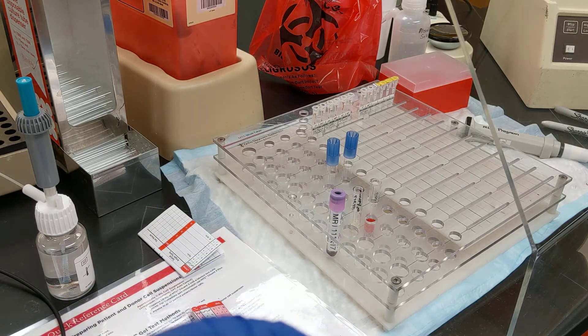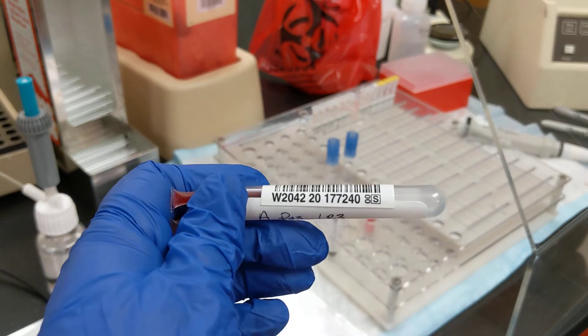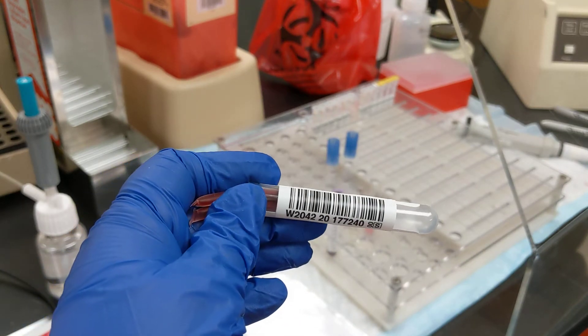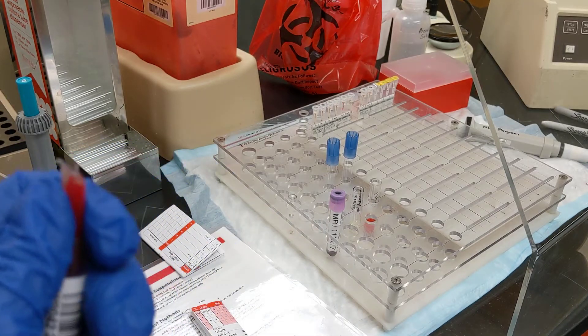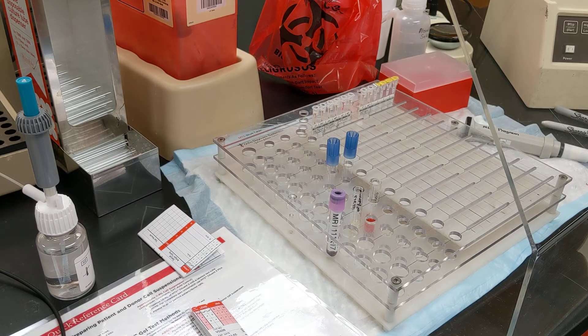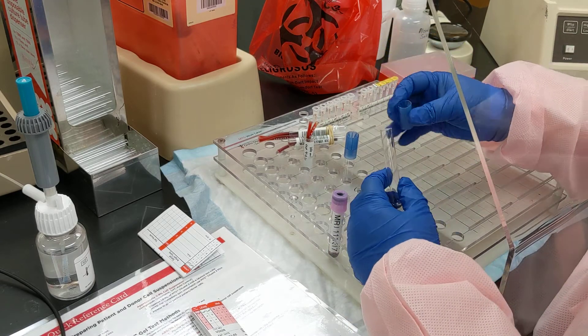We are required to keep segments for potential testing after we have transfused, in case there is a discrepancy or if we need to do some type of other follow-up. So, just a regular tube out of our tube stash.